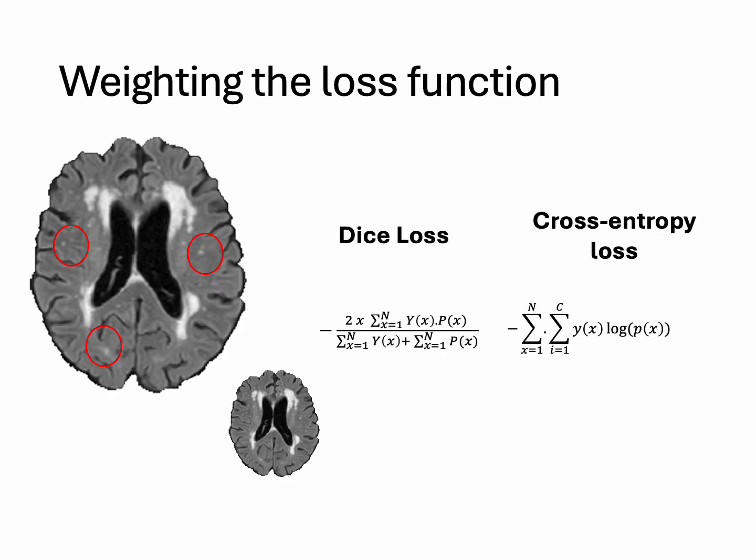So one of the main advantages, or one of the main novelties, of the TrUE-Net is the loss function that we use. So we use a combination of dice loss and cross entropy loss. To give a brief overview of both, dice loss is based on the Dice-Sorensen coefficient, where we have a higher metric for a heavy amount of overlap. The higher the overlap, the higher the metric.